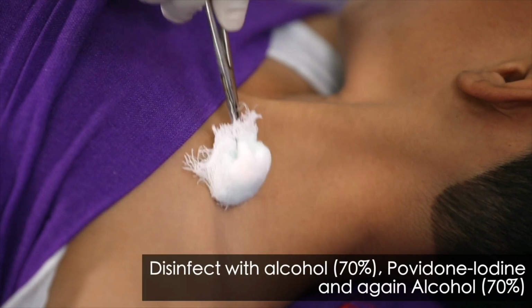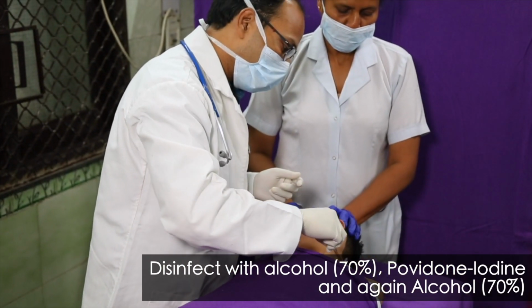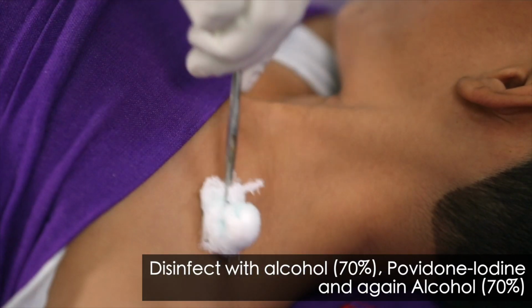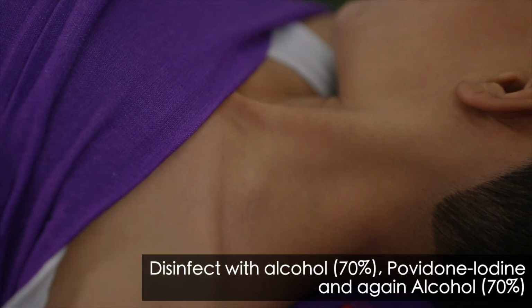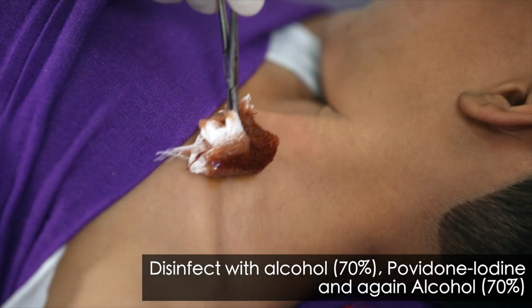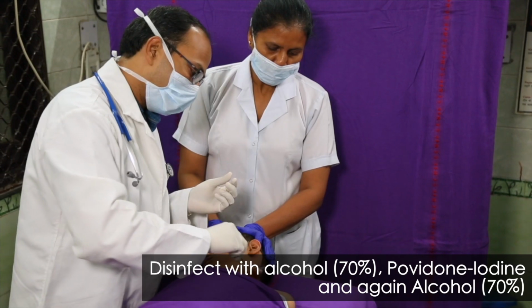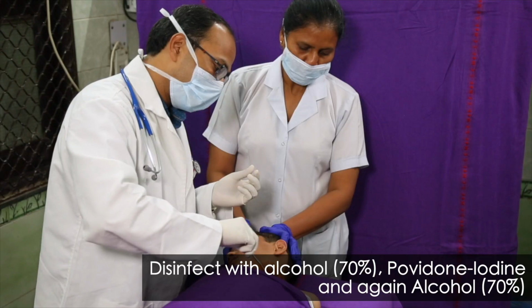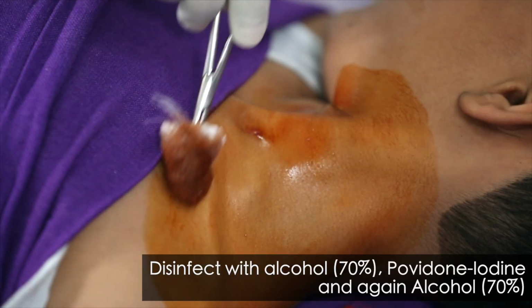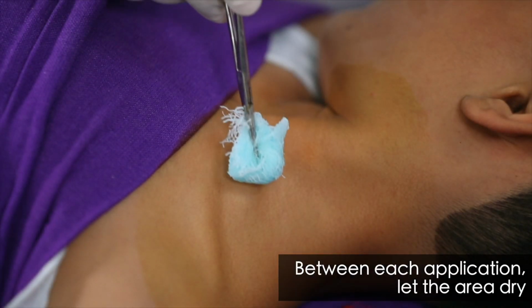Disinfect the skin at the planned needle puncture site. Firstly with alcohol 70%, followed by povidone iodine and again alcohol 70%. Between each application, let the area dry.